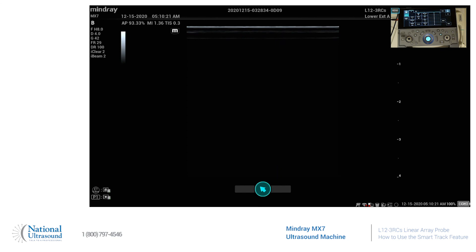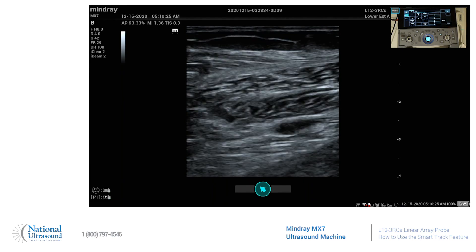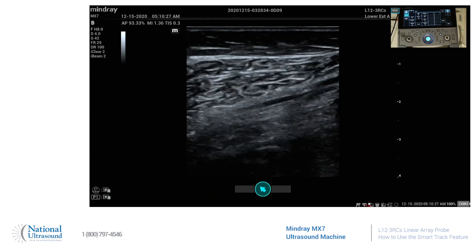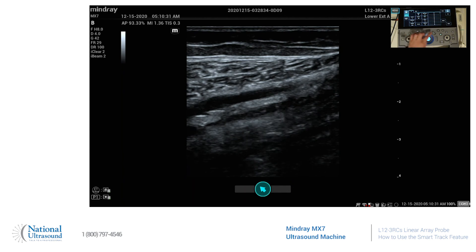We are in the lower extremity arterial setting. I will find my posterior tibial artery and we're going to put color on.